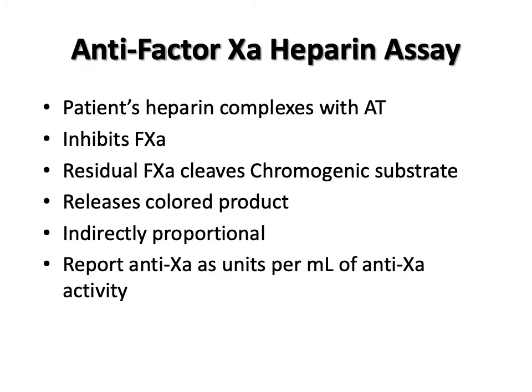The more heparin the standard contains, the less absorbency occurs because of a low amount of residual factor Xa. It is an inversely proportional assay. The same fixed amount of factor Xa is added to the patient's plasma, and absorbency is measured, then compared with the standard curve.